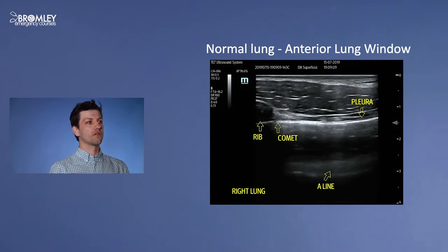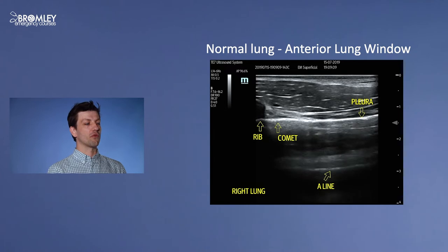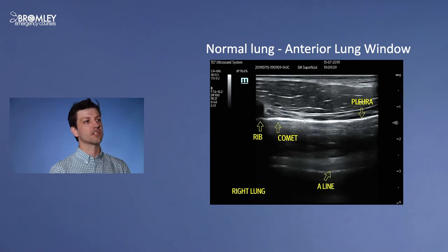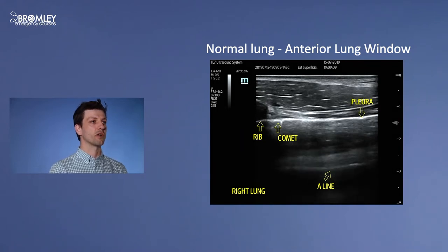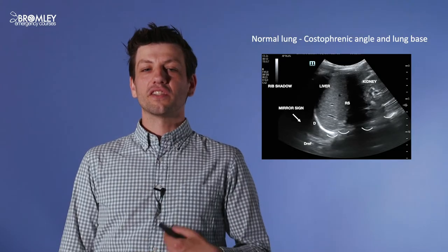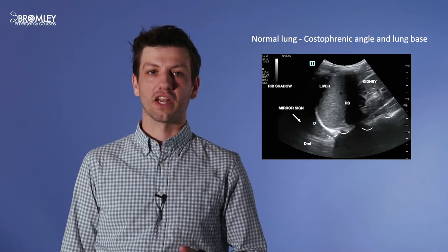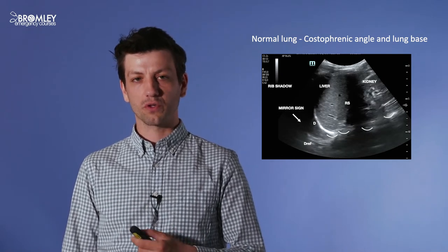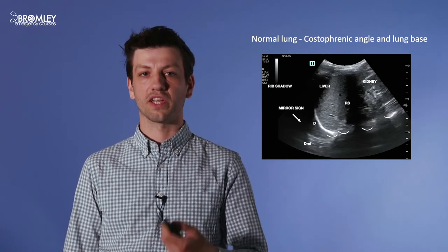Here is a video of normal lung — an anterior lung window taken with a linear high frequency probe. We see a rib, a rib shadow, some comet tail artefacts emanating from the pleural line, some A lines, and lung sliding — a shimmering at the pleural line representing movement of the visceral pleura with normal breathing. And this is a normal lung window from the lateral side, looking at the costophrenic angle at the base of the lung. Here we see a kidney, liver, rib shadows, and mirroring of the liver architecture above the diaphragm — which is normal.